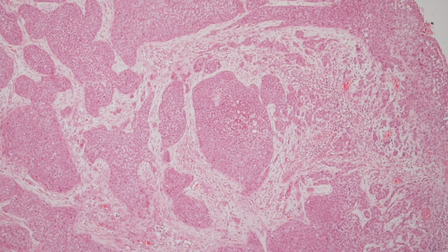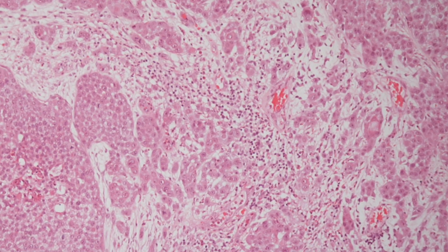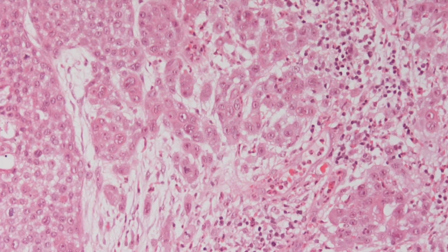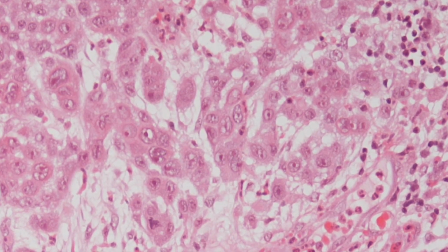On higher power you can see irregular tongues of tumour cells infiltrating the dermis. And here you can see the squamoid appearance of the cells with pleomorphic nuclei and prominent nucleoli.